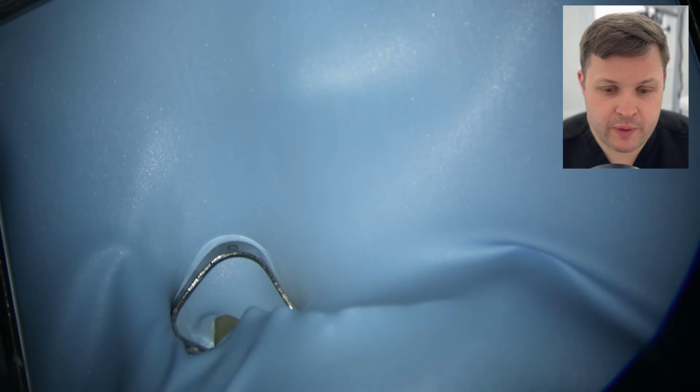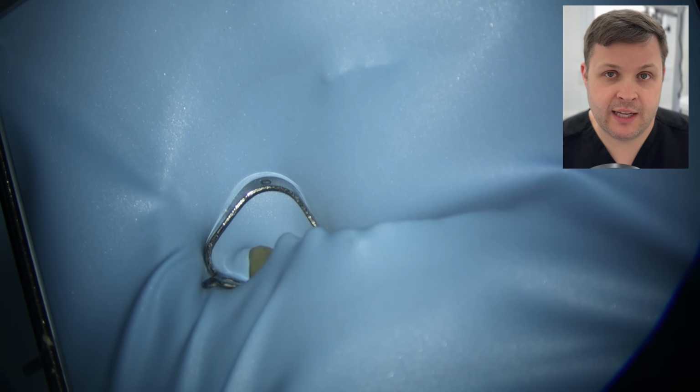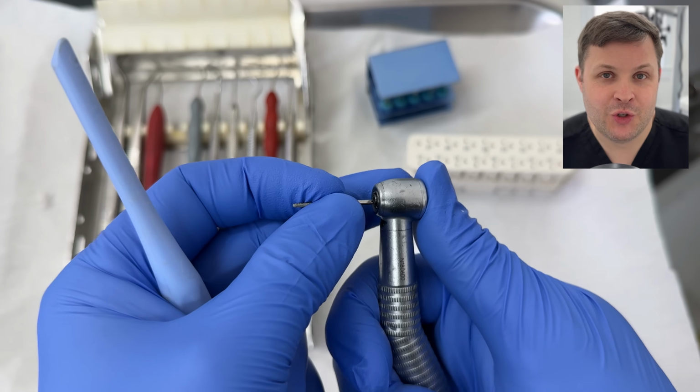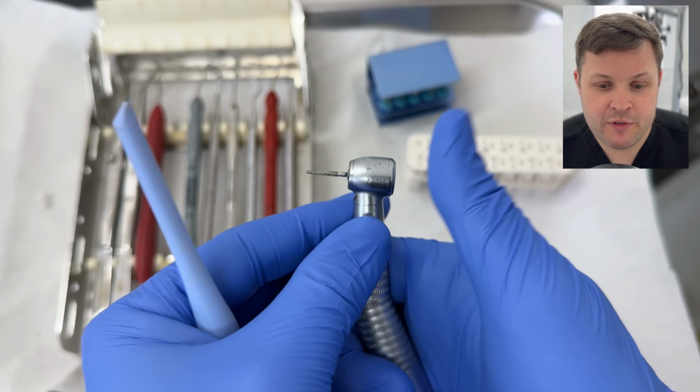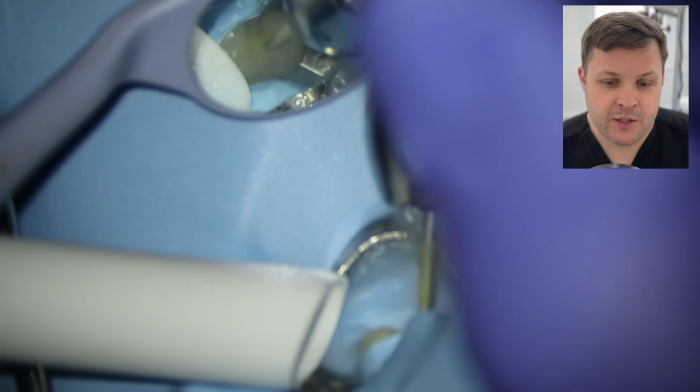Okay, so the first thing we're going to do is place rubber dam. That's really, really important. Use the clamp with the dam at the same time, give it a little bit of a wiggle to make sure it's nice and on, and then I'm going to remove the temporary fillings with a fast hand piece and just a normal torpedo burr.